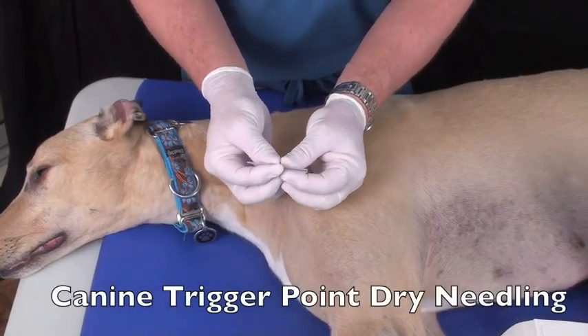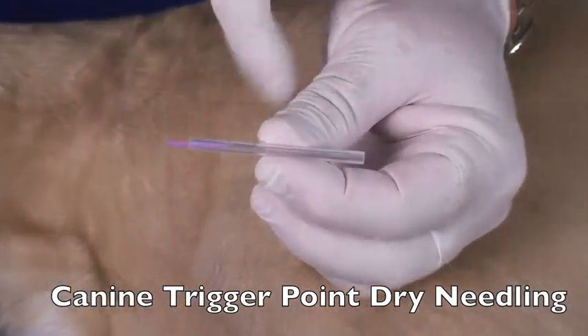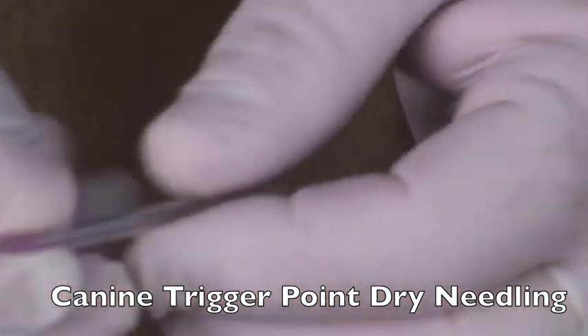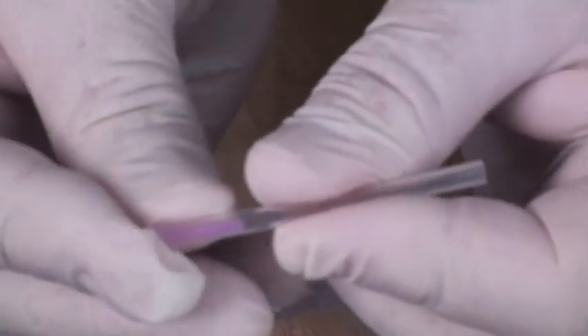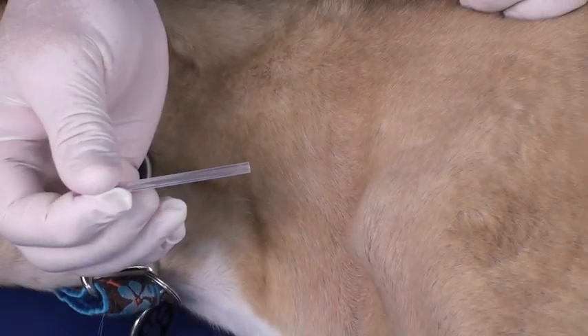The needles we use are Seirin type J needles with insertion tubes. The needle is attached to the insertion tube, and right as you put it on the skin, you break it — that makes it come out. You then tap it really quickly, which bypasses some of the pain sensation by doing it real quick.